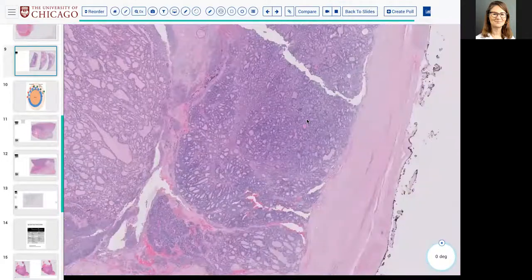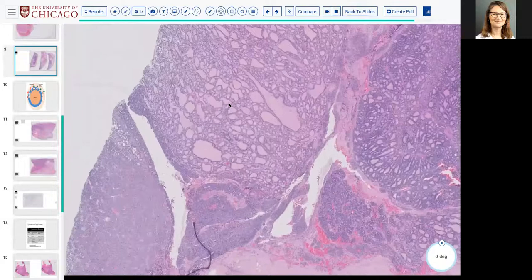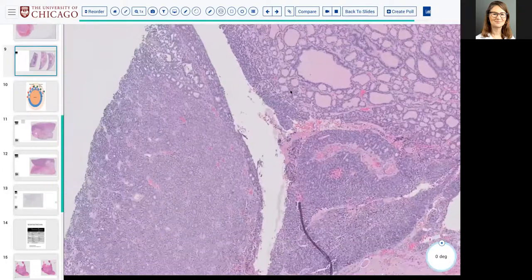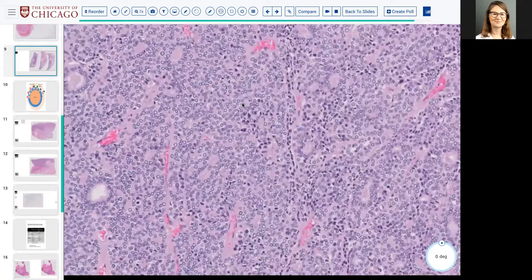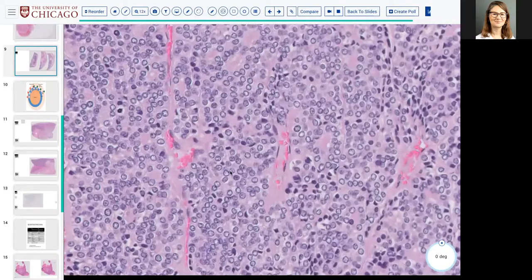Okay, good. So thing one, I'll pause you there and I'm going to make you continue. But thing one, areas like this, fine, follicular neoplasm, we will evaluate it. Areas like this, where you start to get sort of sheets of cells with follicles percolating in between them, concern yourself, okay? So concern yourself with areas that are now wall to wall with capillaries on left and right.